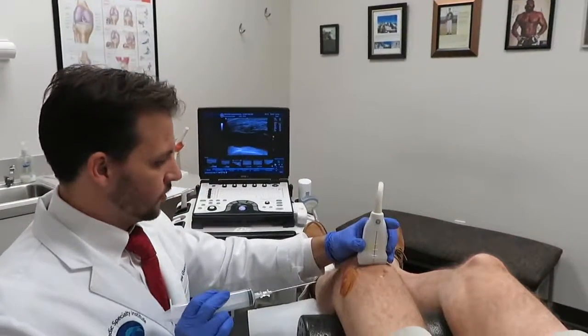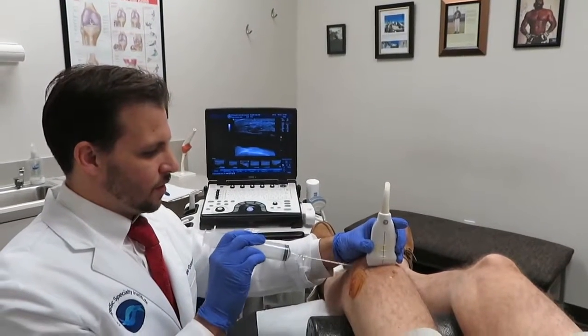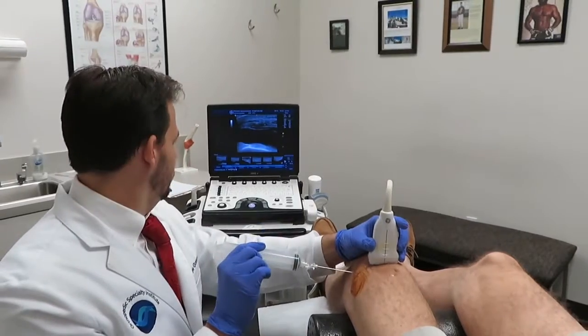So we just numbed the subcutaneous tissue and now we're going to take all that fluid out of this. So a little bit of a poke — one, two, three, there it is.